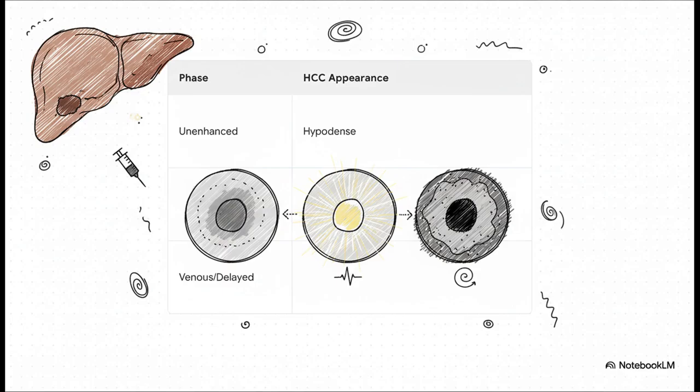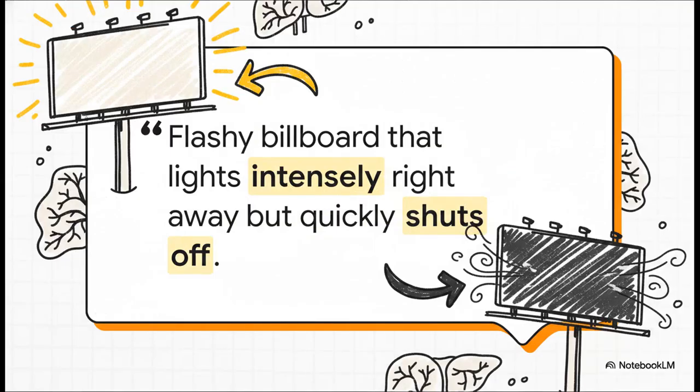It doesn't blend in. Nope. It gets dark again fast, even darker than the liver tissue around it. And the analogy for this one, it's perfect. Think of a flashy billboard on the highway.